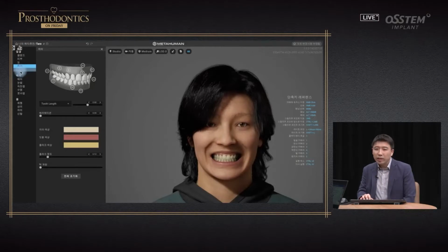If you look closely, you can adjust the color of gingiva, tooth, and whether there's plaque or not. Tooth width and height, different adjustments can be made. The purpose of this is not for dental treatment, but if you look at the eyes, this can be adjusted as well. And even in the dental field, I believe we'll be able to utilize MetaHuman for treatment as well. This is what I've prepared for today.